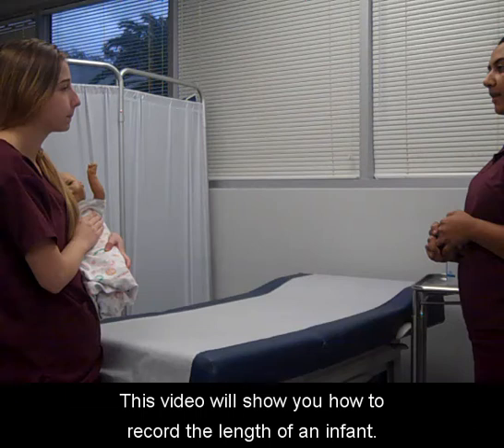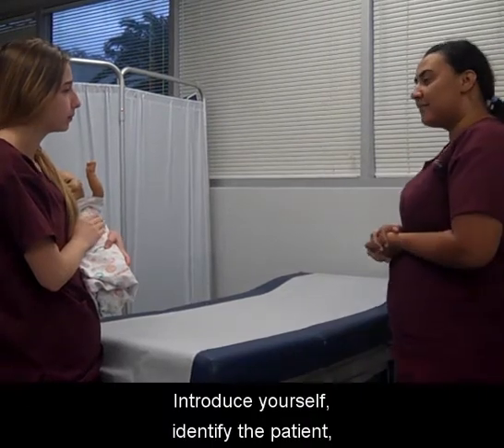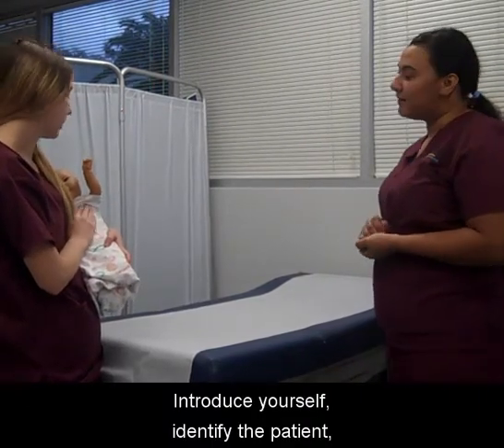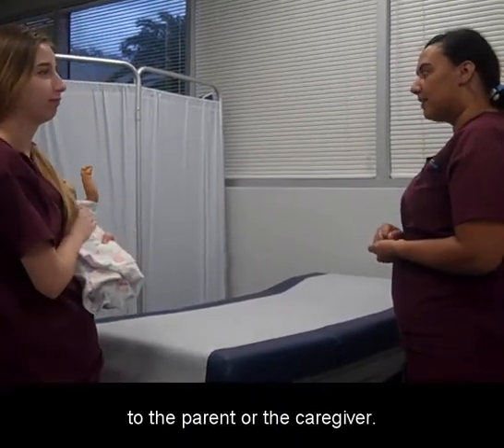This video will show you how to record the length of an infant. Introduce yourself, identify the patient, and explain the rationale for performance of the procedure to the parent or the caregiver.